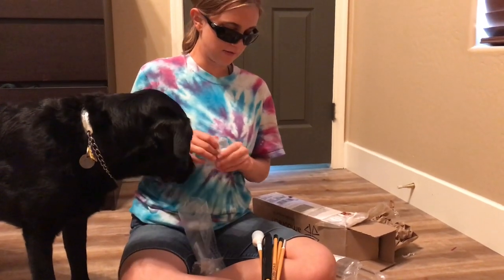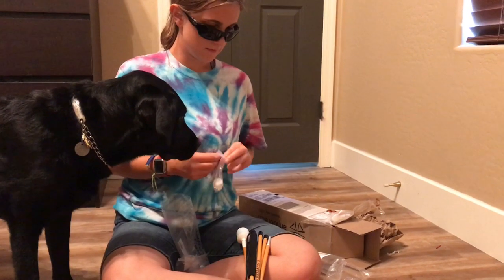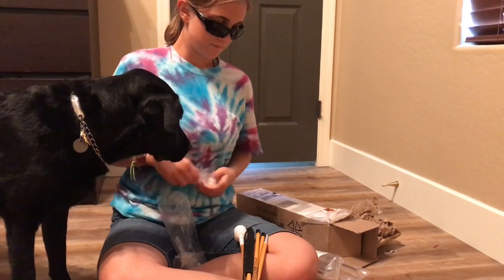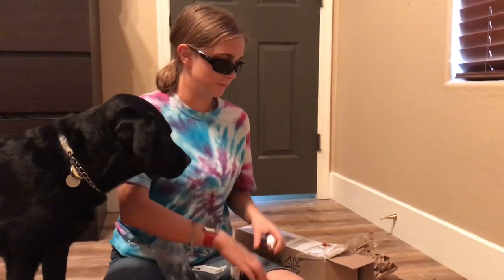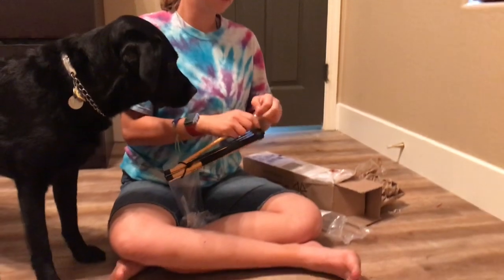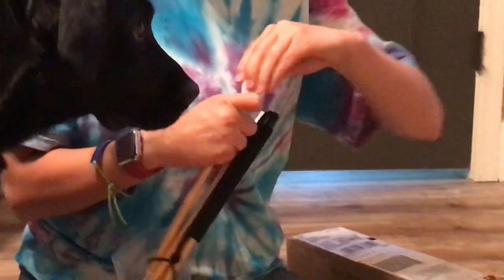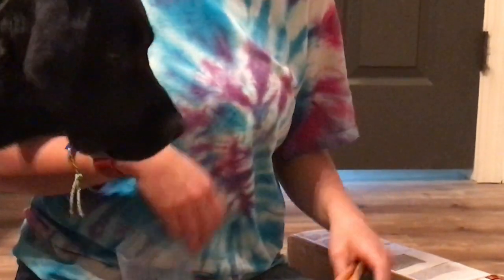And then I have... It's like a tiny marshmallow. That opens way easier than all of the other ones. This is a non-rolling marshmallow tip, actually. So, kind of threading, unthreading. Woo! There we go. This is 2-point touch marshmallow basic.